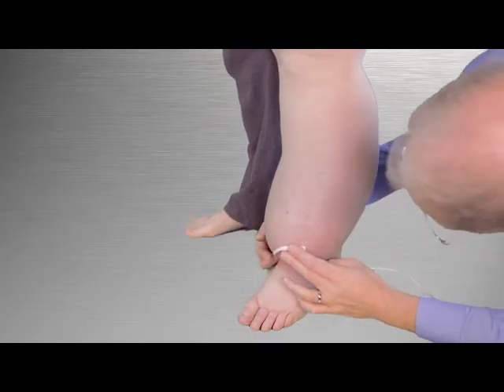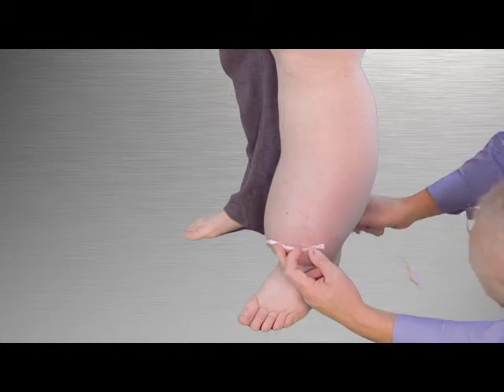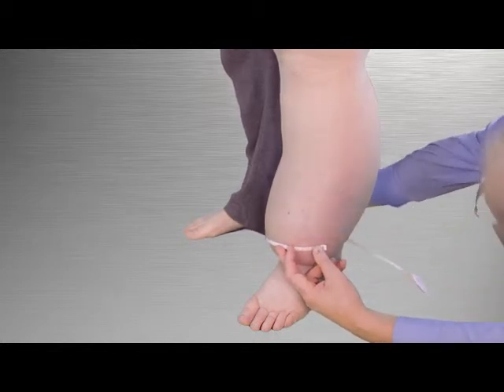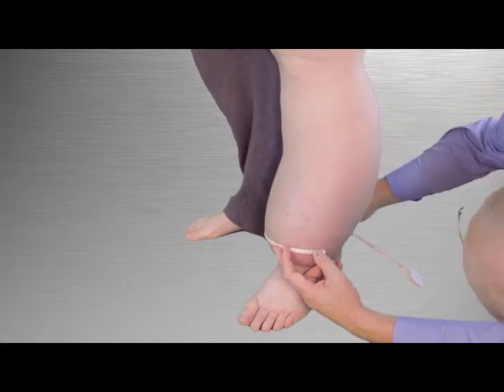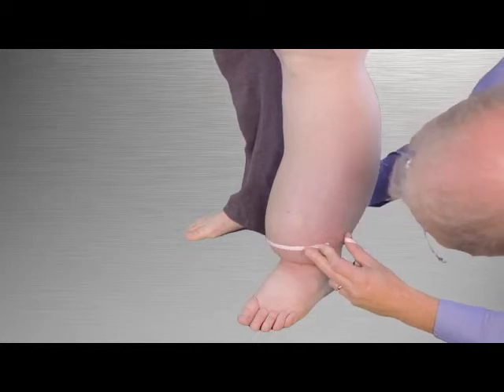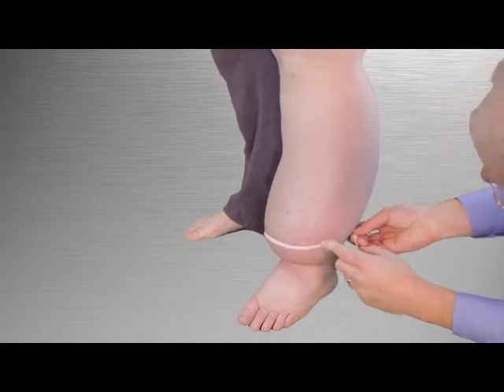Next, wrap the measuring tape around the leg at the lowest point possible to obtain a good circumference measurement. Since this will be the last circumference measurement before the ankle, it is important that it is not too high. Make sure the tape is held parallel to the floor, as this is the zero point reference line for all future measurements.